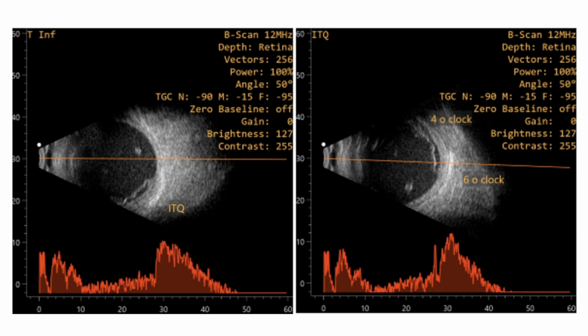Any guesses? It looks like it is going up and attaching there to the retina. This eye has undergone vitrectomy for endophthalmitis. Uncut gel, possibly. When you're doing the scan, you will see the mobility, and that's possibly uncut gel. Could be a drug precipitate also.